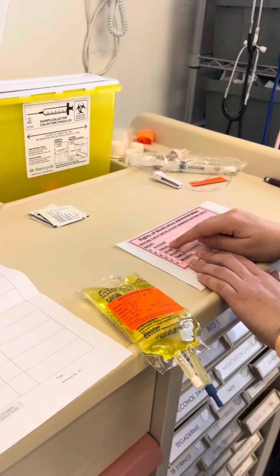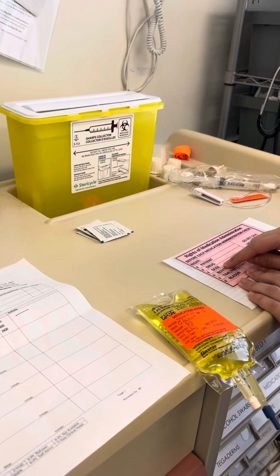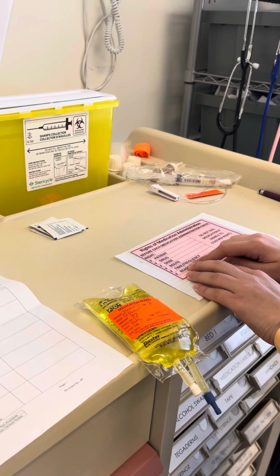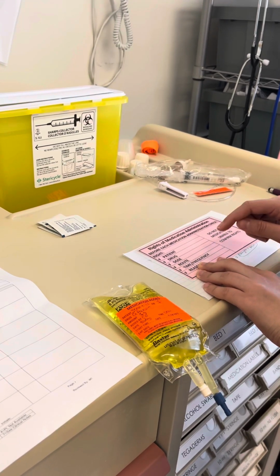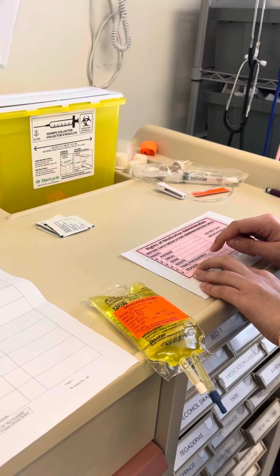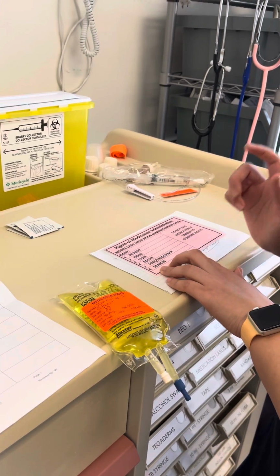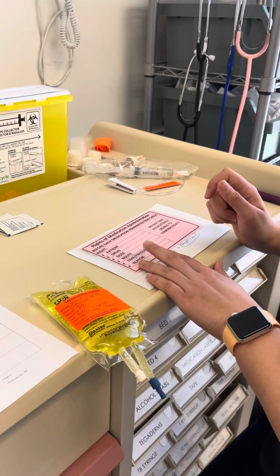So I'll do my second check. Patient, generic, drug, cefazolin, dose 1 gram, route IV. Time, we're gonna administer it over the course of 20 minutes. It's every 8 hours for 2 days. It's 8 o'clock, so we're good to give it. Reason, it's an antibiotic, most likely have an infection.